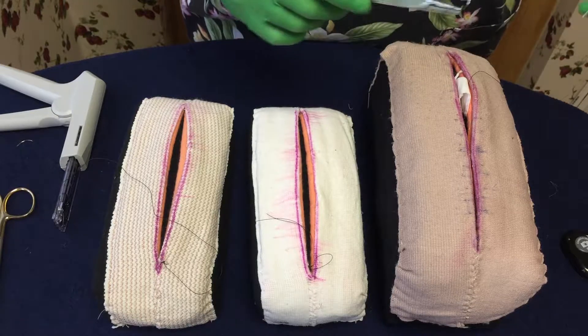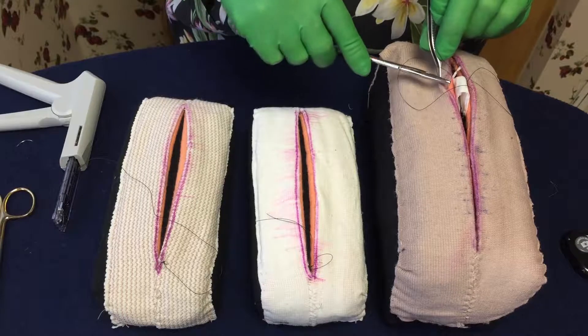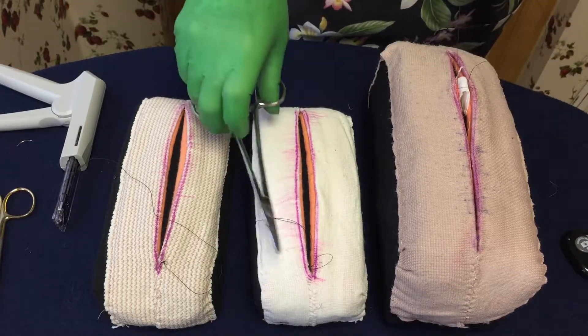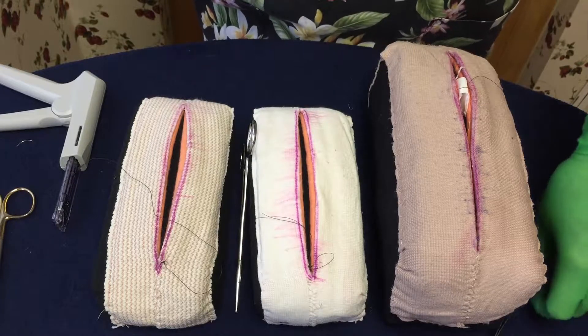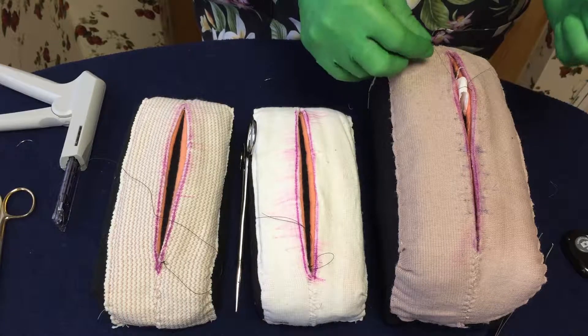Make sure you have control of where your loop is. On this side, I did not want to catch the extruding tissue, so I'll make sure I can see what I'm doing. When you're ready to tie the extruding tissue and get rid of that underneath, that loop is on top of it, which is going to help push it down.